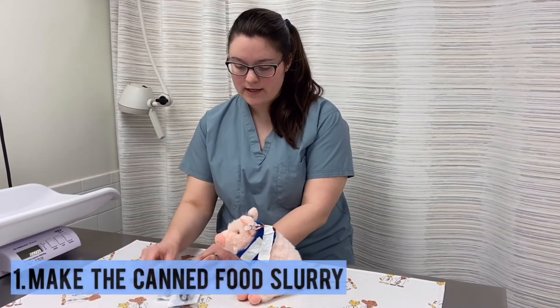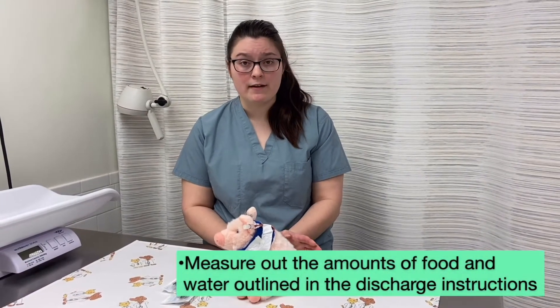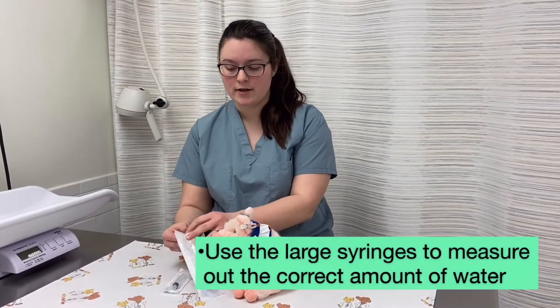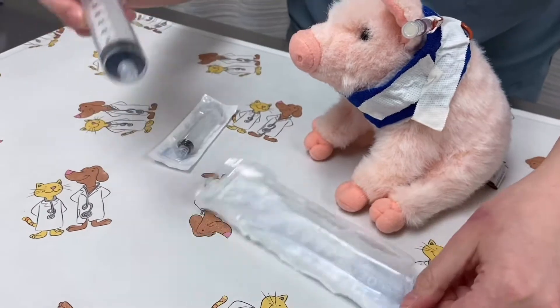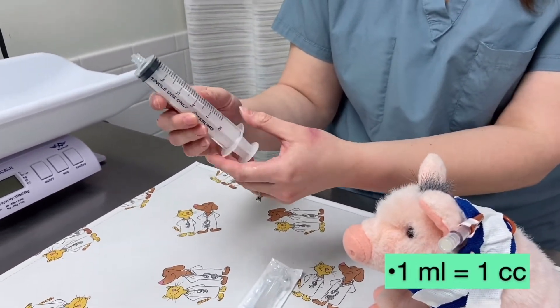To make up the feeding, you're going to have directions in your discharge that ask you to mix a certain amount of canned food with a certain amount of water. You can use these large syringes to make sure you have the correct amount of water. They have a tab and you can just open them right up. Usually you'll be sent home with a box of 60 mil syringes or cc's. Mils and cc's are equivalent.